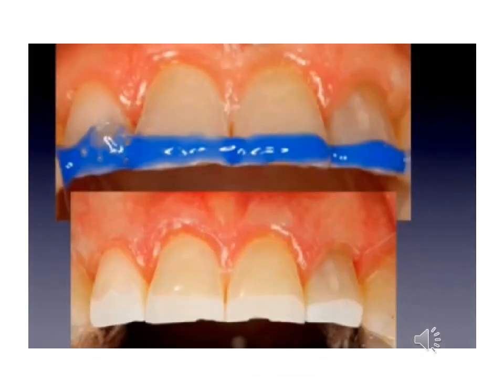Here in this picture, as you see the acid etching, then after that washing and drying, and we see the chalky appearance of the enamel surface on the anterior teeth. That means that the etching is a success.